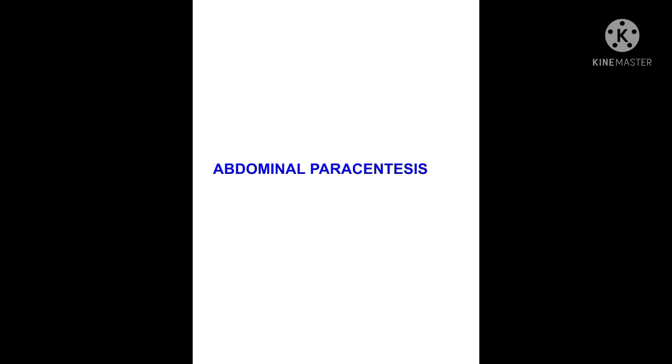post-paracentesis hypotension, dilutional hyponatremia. Post-procedure instructions. The patient should be instructed to monitor the bleeding of the area and return if any abdominal bleeding is noted. The patient should also be educated to call with questions or concerns regarding pain, numbness or discomfort in the area. The patient should also monitor for evidence of infection. Lastly, the patient should be advised to clean the area with warm soap and water and pat the area dry.